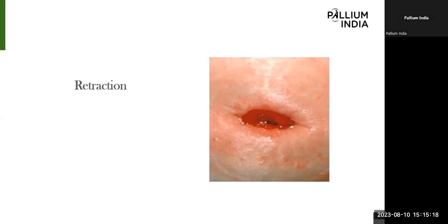But here, in this retracted state, there is a gap on both sides. While using a normal colostomy bag, with the normal faceplate, a space will occur in between. Due to the space, the parastomal area will get in contact with the fecal matter or the waste material coming from the stoma.